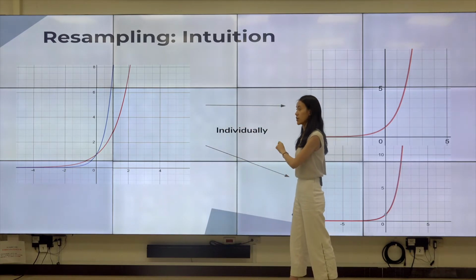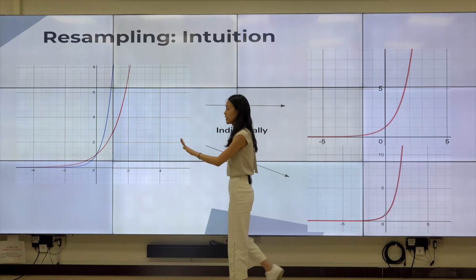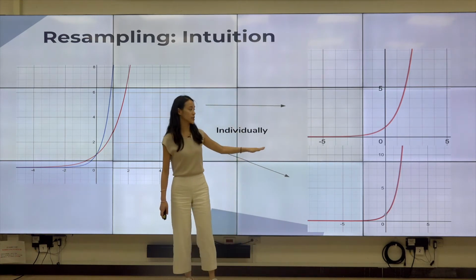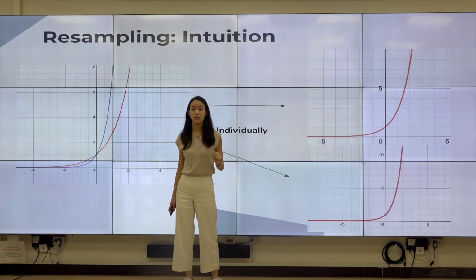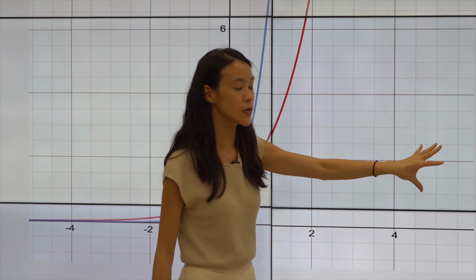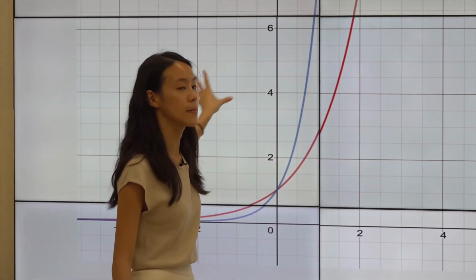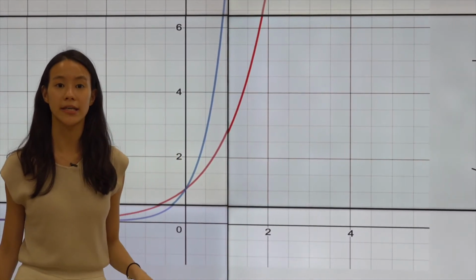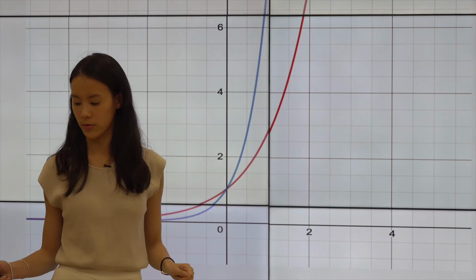One increases exponentially faster than the other, but it wasn't differentiable when we split them up into two. So this is where resampling becomes important. We're having both of the images on the same scaling, on the same grid, so that they can become more comparable, so that registration is a lot easier for the entire algorithm itself.